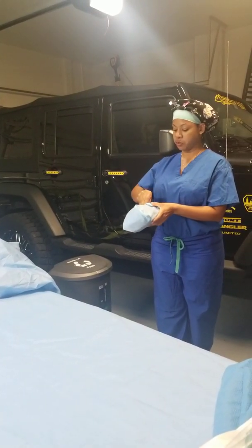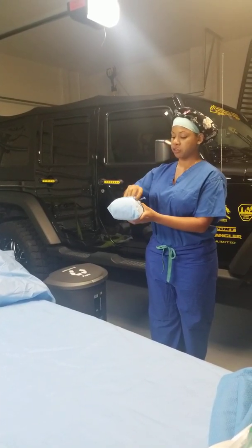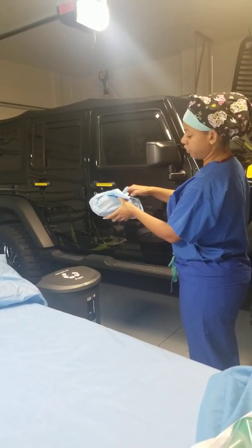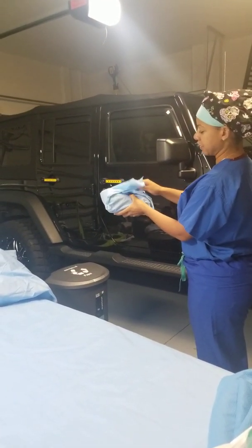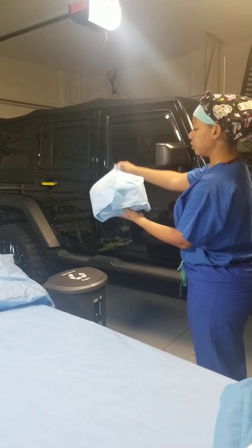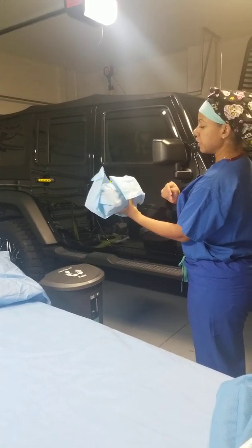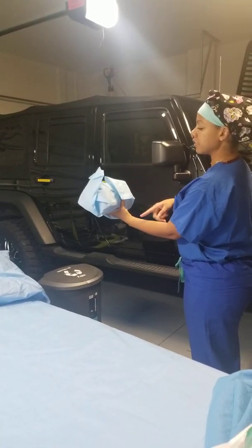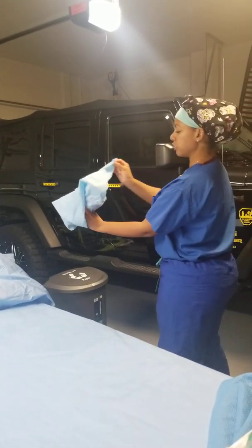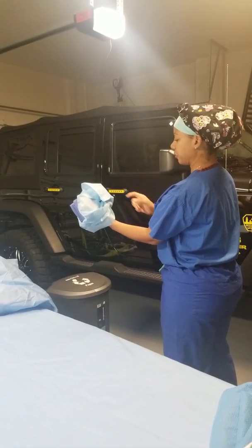You're going to rip your tape. You're going to pull your tab out, and I like to stick my hand in what I call the mouth — so it's going inside here. You're going to take the top tab, pull it up and over, and secure it under your finger. Then you're going to take whatever is handed to you — you don't reach over. You're going to turn your item, pull that out and under, and secure that with your finger.